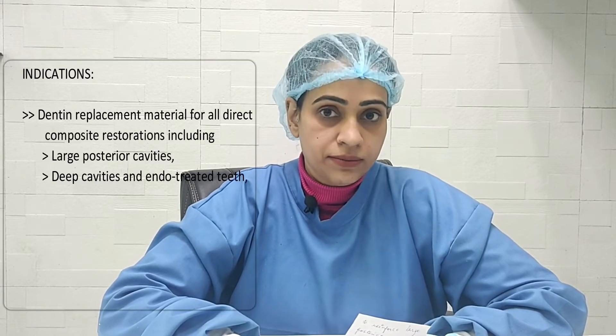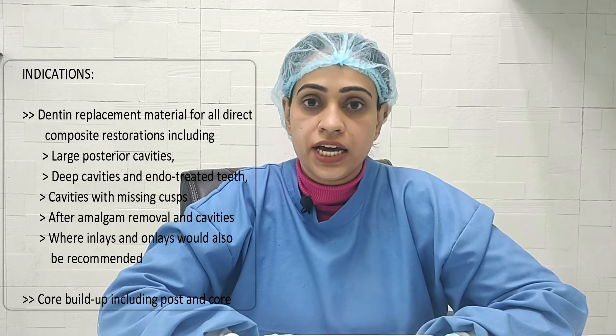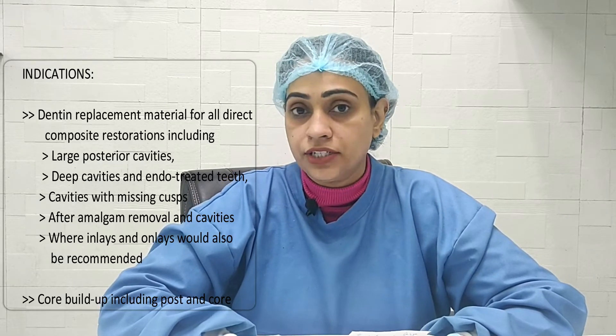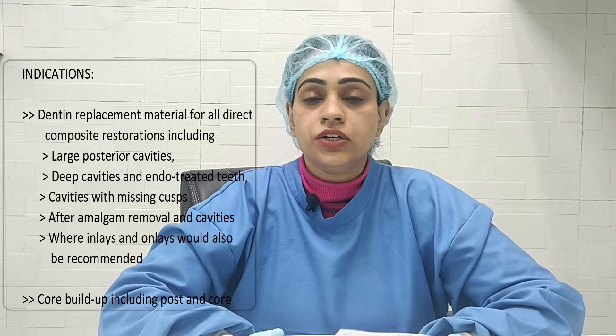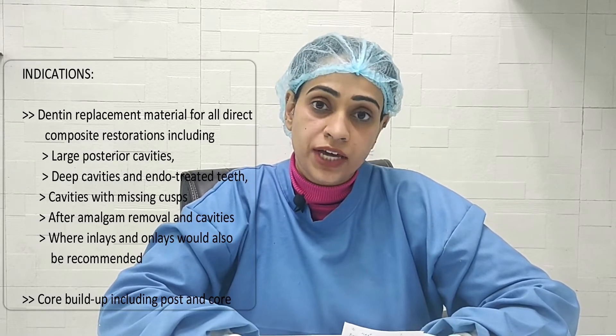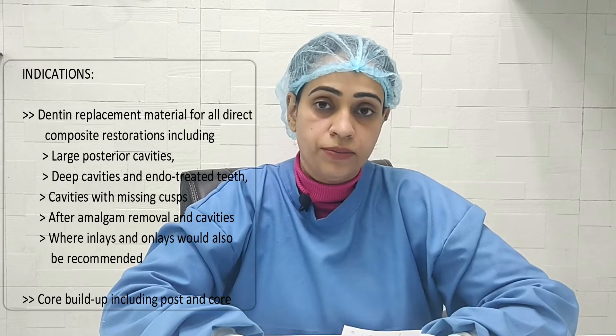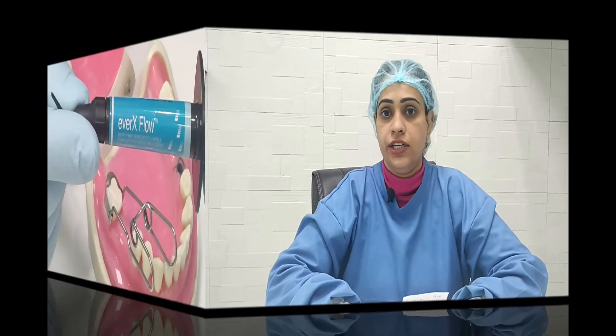Since it is fiber-reinforced, the strength of the composite is very high. We can also use it in cavities which have cusp fractures — your repeat cavities that have composite fractures. Because of the fibers present inside the composite, the fracture resistance is very good, and cuspal fractures and composite fractures are also taken care of.